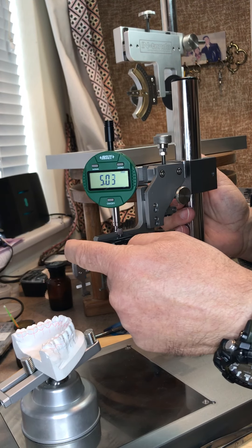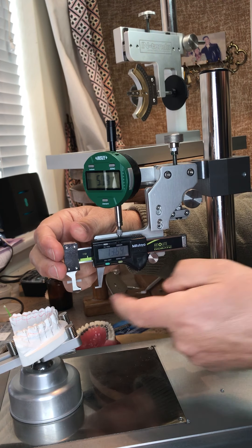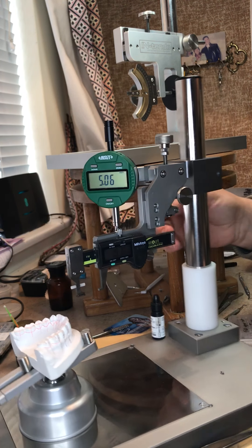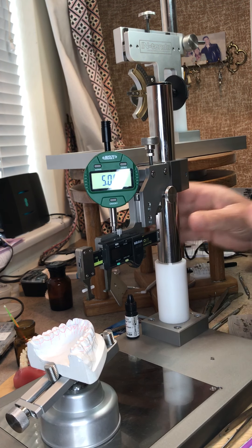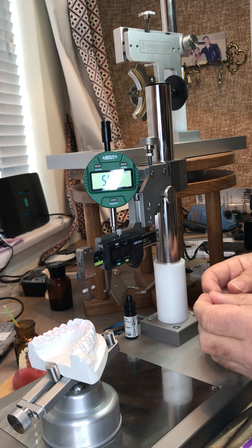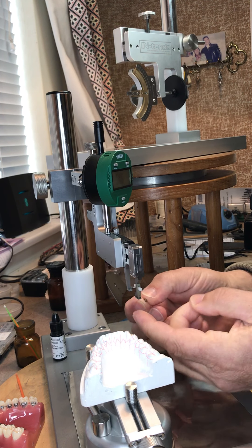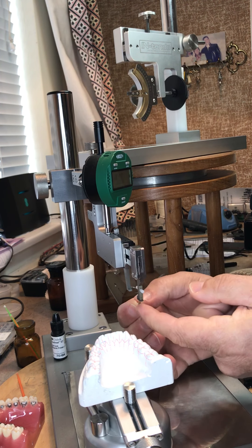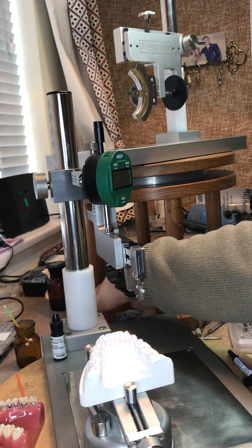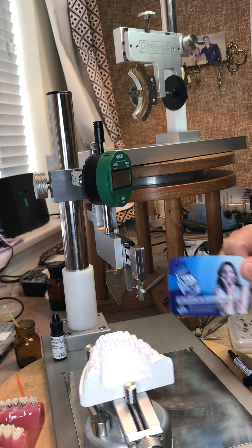I have the calipers here which I can slide in and out, which hold the bracket via jaws. I can put the bracket onto the tooth by measuring from the incisal edge, the cusp, or whatever reference point we want to take it from. To put the bracket on the tooth, I push the jaws open, making sure the bracket is open — this is one of our new IN-tendo self-ligating brackets.